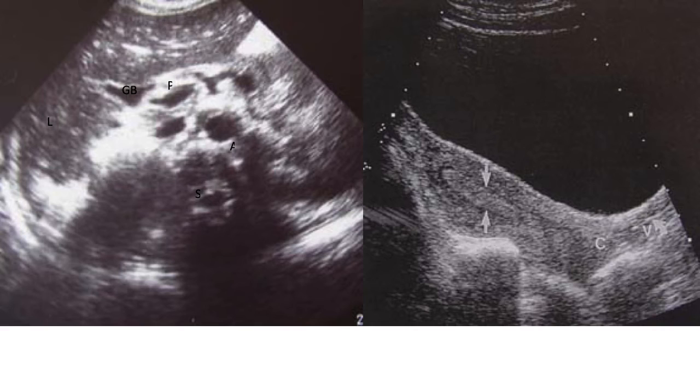And in front of the uterus, this is a sagittal view of the pelvis. In front of the uterus, you can see this big black image. Okay, that's the bladder, which is full of urine. So for that reason it is anechoic. Remember anechoic. Then I talk about another study, CT scan.